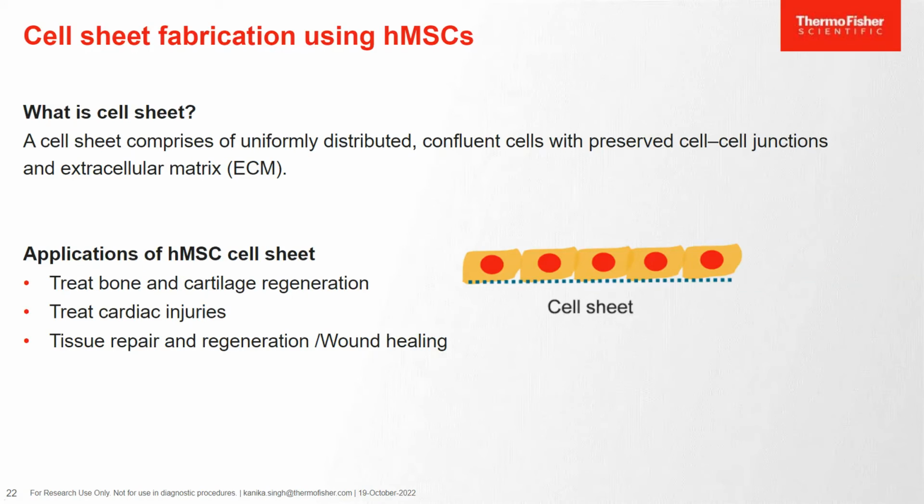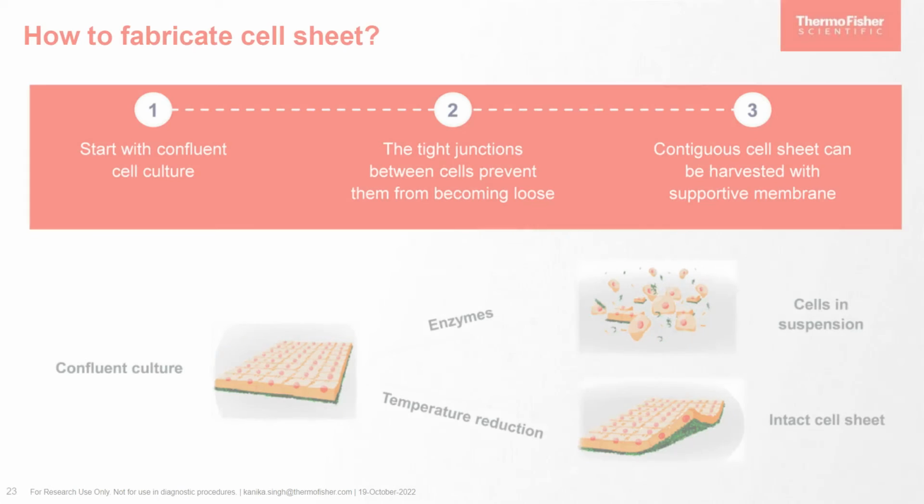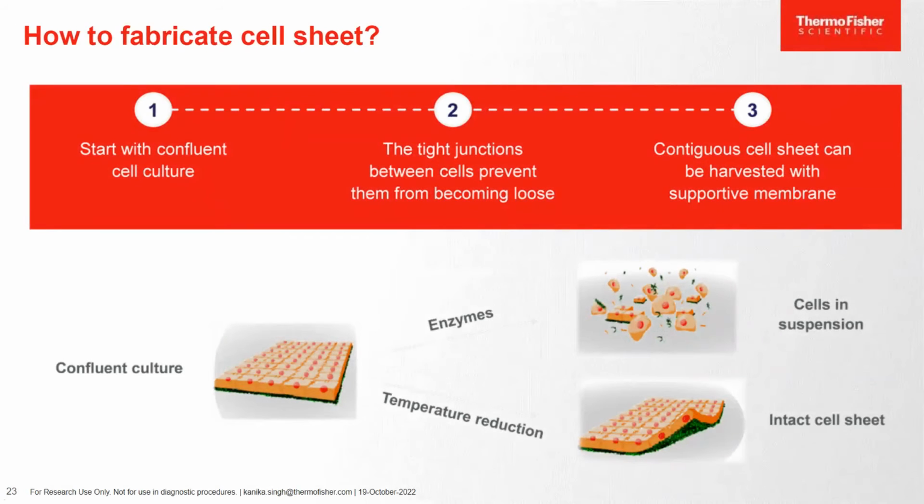And then there are multiple research papers wherein you will find the application of these hMSC sheets for tissue repair, regeneration, as well as wound healing. Okay, so how to fabricate a cell sheet? So how to use UpCell Surface in order to make a sheet of any kind.